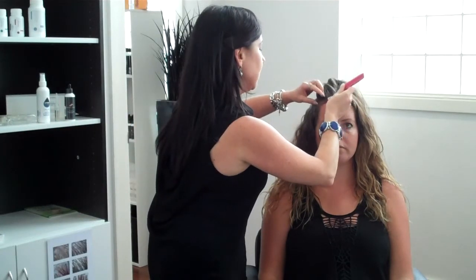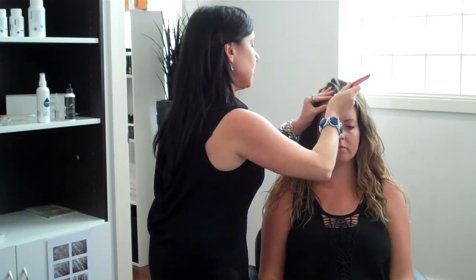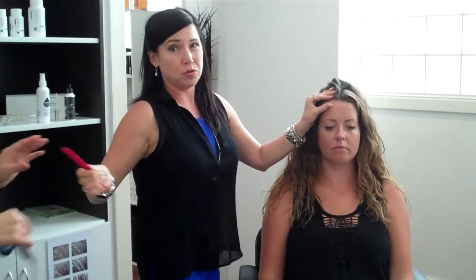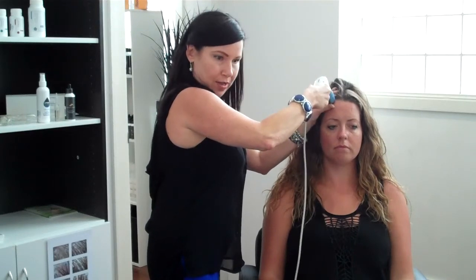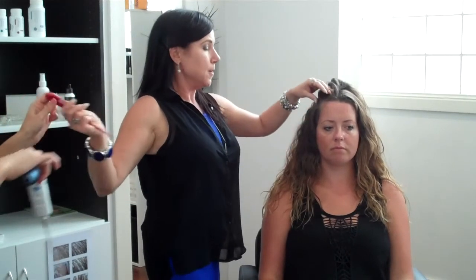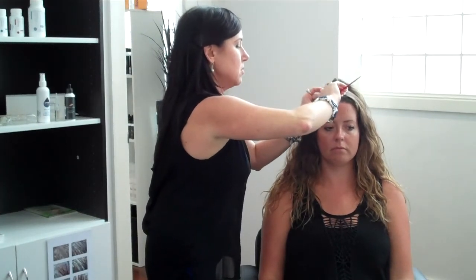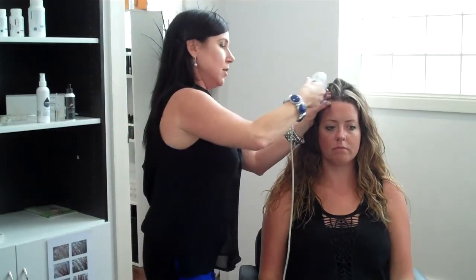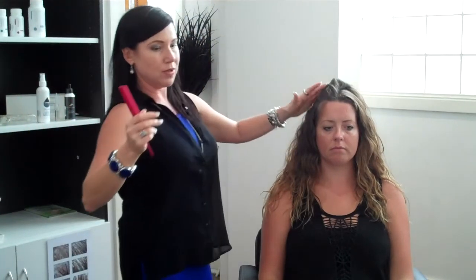Make sure you get a nice clean parting, and be sure when you're taking your before shots that you take it where you want to improve the hair. I went before the hairline and now I'm holding out of the way all these new hairs, and that's really impressive to show your client four months later. Get a nice clean section, push it down and take a clear image. You basically keep doing that for all of the sequences.